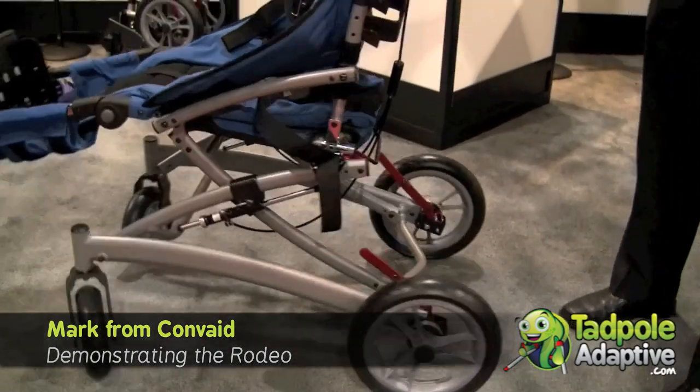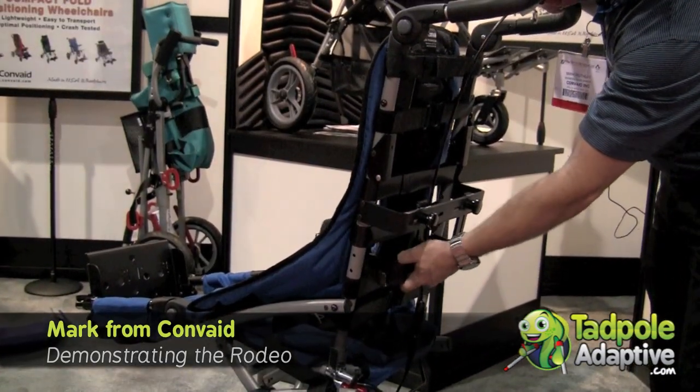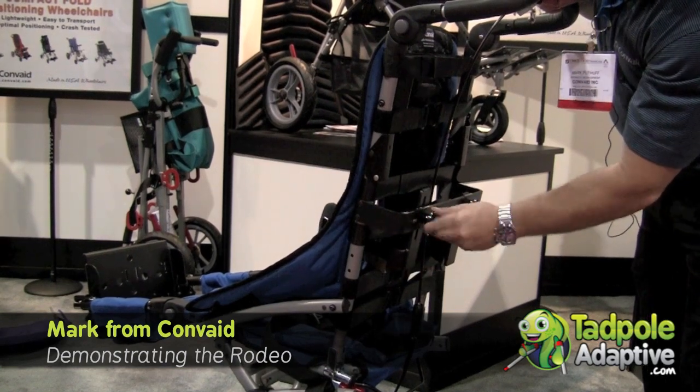To adjust the laterals — I love this on the Rodeo — we just loosen right here. It allows them to slide left and right and up and down quite easily. Then we just tighten in place.